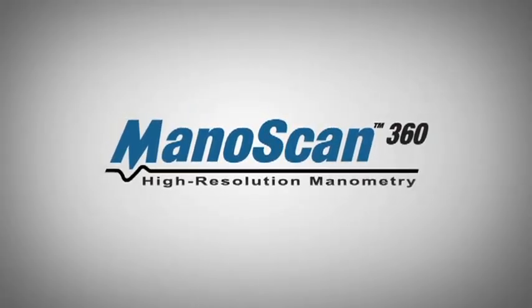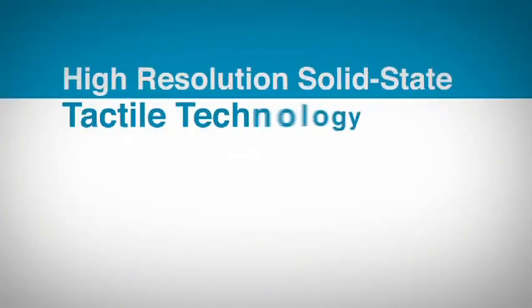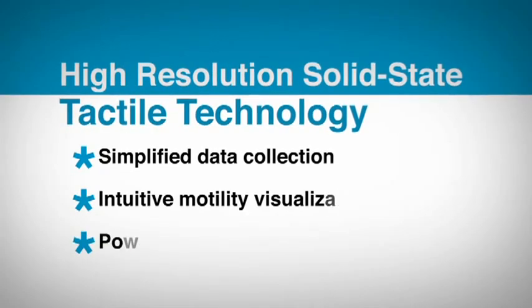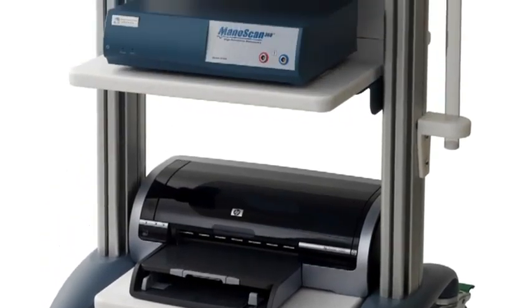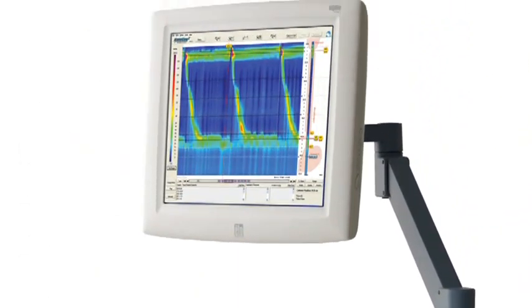Manoscan, motility made simpler, faster, more precise. Powered by high-resolution tactile technology, Manoscan simplifies data collection and provides an intuitive visualization of motility. It gives greater diagnostic information while reducing procedure times by up to 50%.